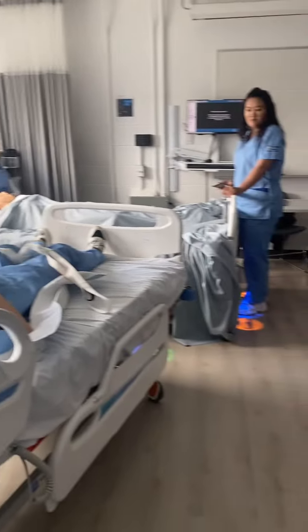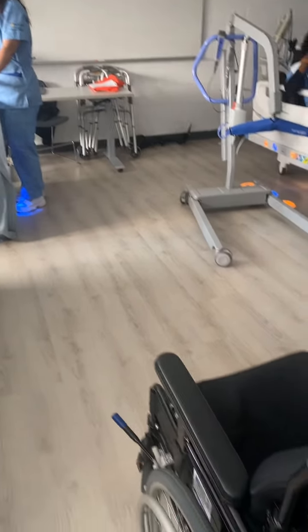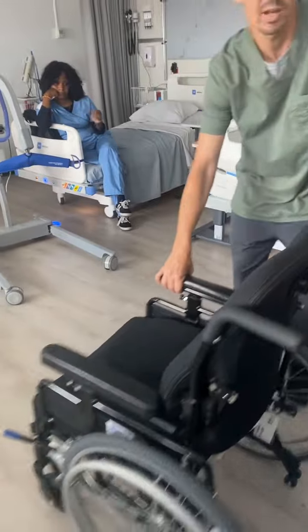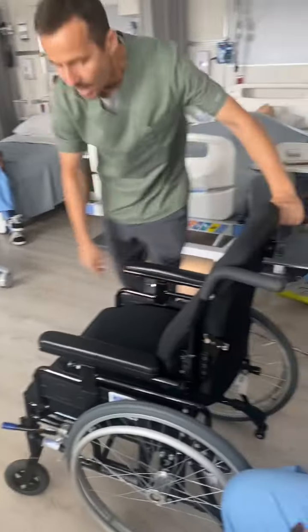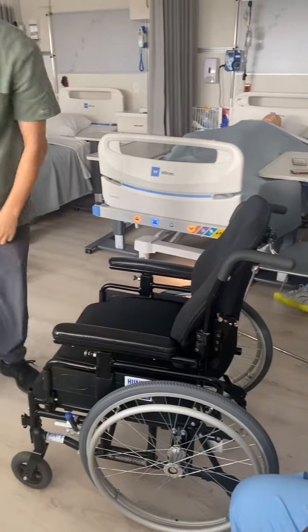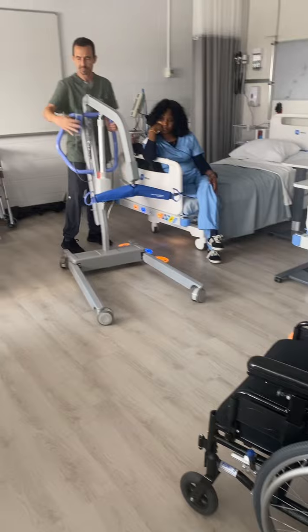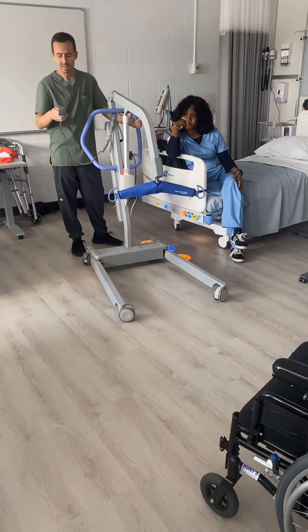You can set up the chair wherever you want to. We have room, so I'll just put it here. I'm going to set up the chair over here. You can do all of that on your own, right? You can bring the lift in.